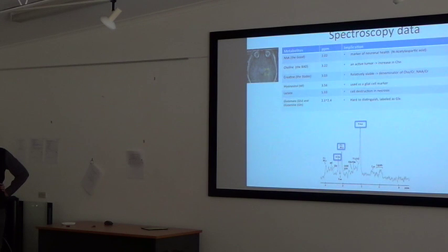The third is creatine, usually stable, so it usually serves as the denominator for NAA and choline. The fourth, MI, is used as a glial cell marker. Lactate is hard to detect in healthy subjects, but an increase usually indicates necrosis. Glutamate and glutamine are usually hard to distinguish, and are labeled as Glx in the references.